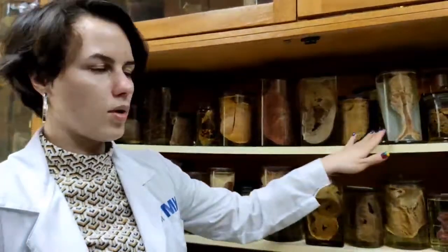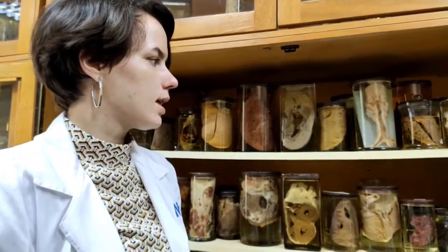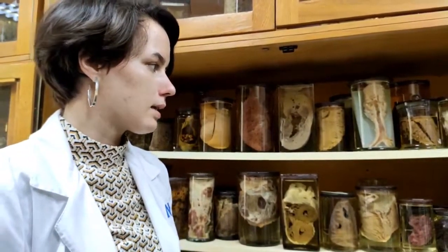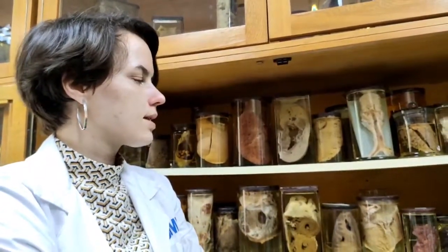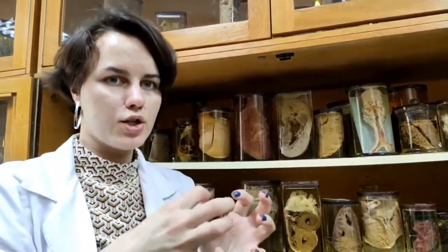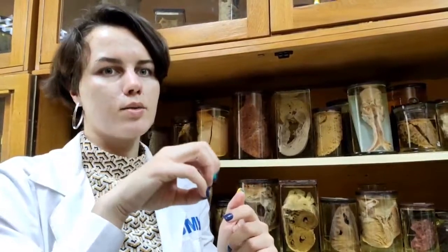The same in scleroma. When I see diagnostic cells of scleroma under the microscope, I know that this is scleroma. We will see this slide in our list of slides too. And when you are talking about scleroma, you should know the name of the diagnostic cells. In this disease, these cells are called Mikulicz cells. Mikulicz cells are macrophages with these bacteria in the cytoplasm, Klebsiella rhinoscleromatis, I mean. Macrophages with Klebsiella rhinoscleromatis are called Mikulicz cells.